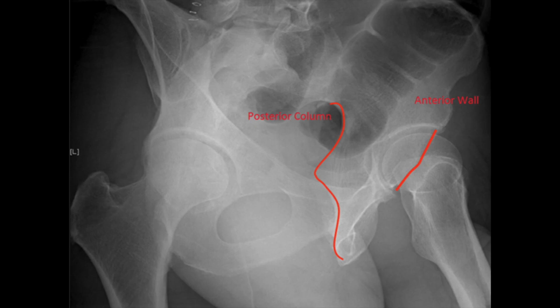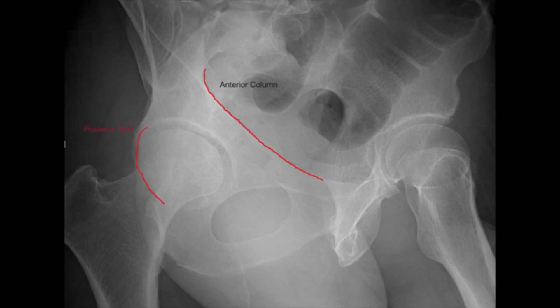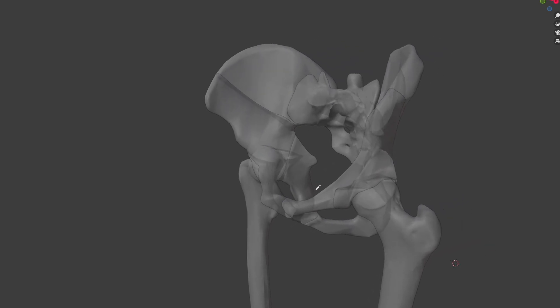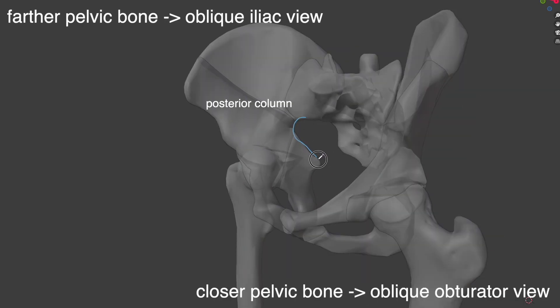To give a real-life example, this x-ray is a right Judet view showing both the oblique iliac view and the oblique obturator view. Unlike the AP view, we need to look at both sides of the Judet views — on this right Judet view, we can only visualize the posterior column on the left side of the pelvis. To examine the posterior column on the right side, we have to switch to the left Judet view.